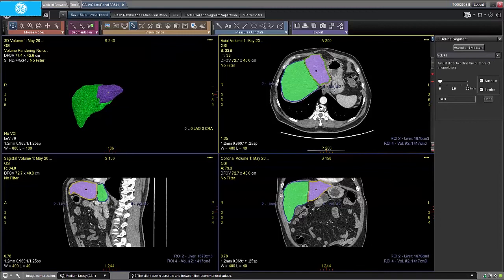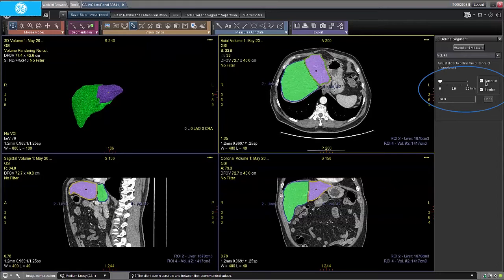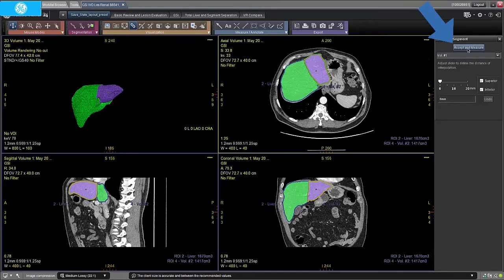The editing process is similar to the one used before, including the possibility to interpolate superior, inferior, or both. When satisfied with the segmentation, click on Accept and Measure.